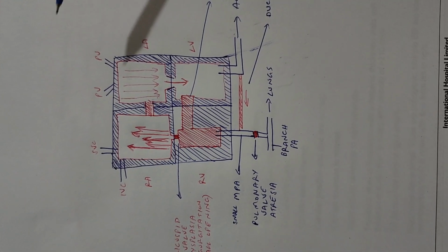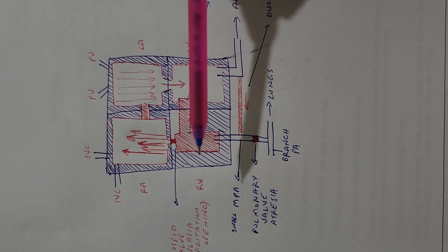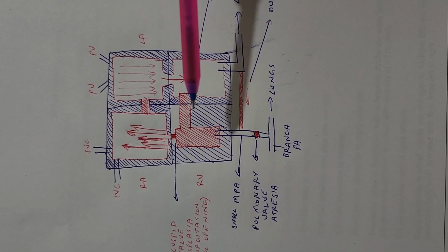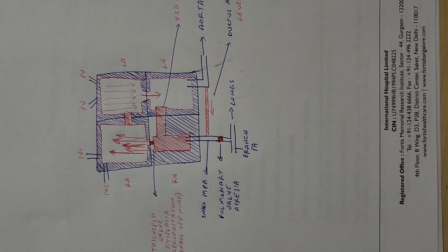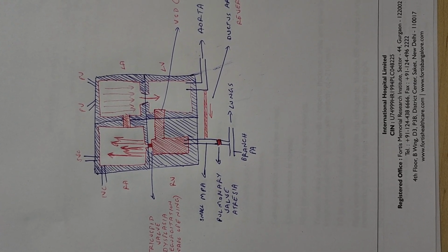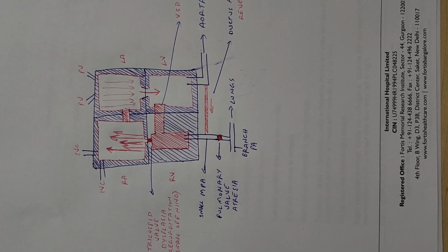So also the RV had multiple echogenicities with thickening of the tricuspid valve, increased echogenicity of the interventricular septum and also free wall. So this will help the patient understand what has gone wrong and acceptability becomes easier. Also, this will help the pediatric cardiologist and cardiac surgeon to understand what we are trying to tell them.